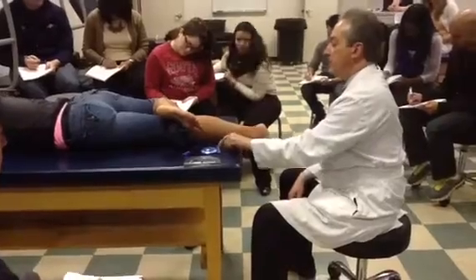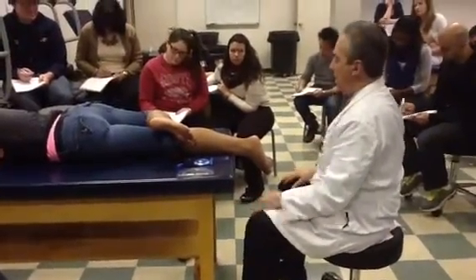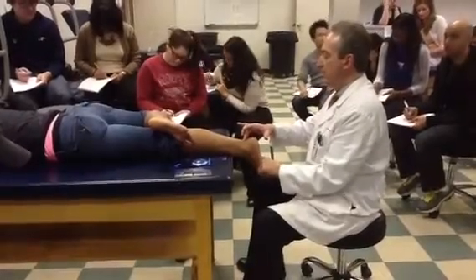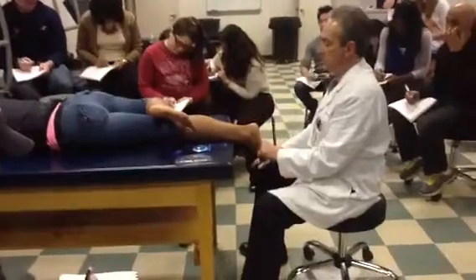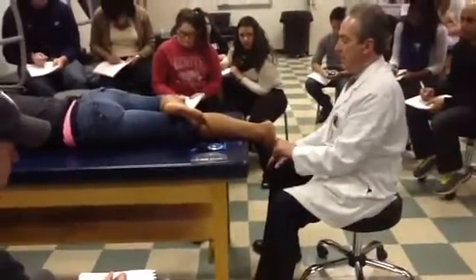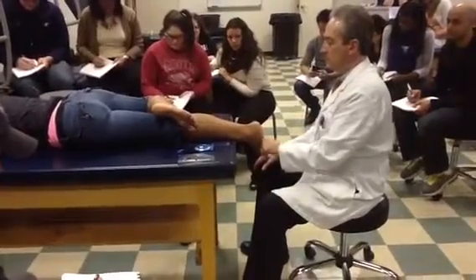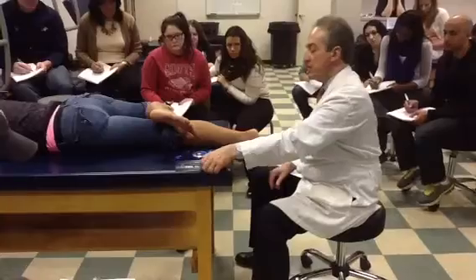Subtalar joint range of motion is probably one of the easiest measurements you can obtain. All right? All we need to do are a couple of things. One, we need to find where the pivot point is for our calcaneal inversion and eversion. Okay? It's easy to do. Just abduct the foot, evert the calcaneus, adduct the foot, invert the calcaneus. Okay? Then we just want to take our measuring device.